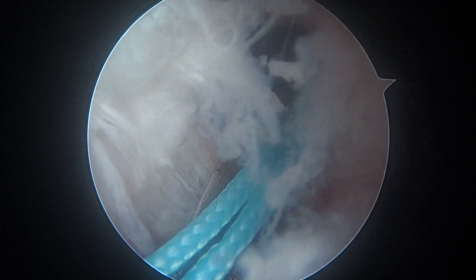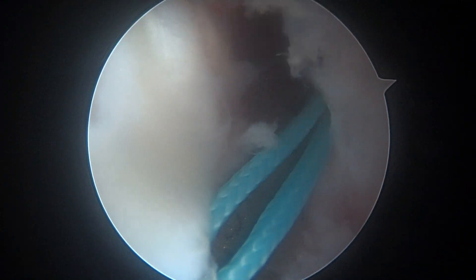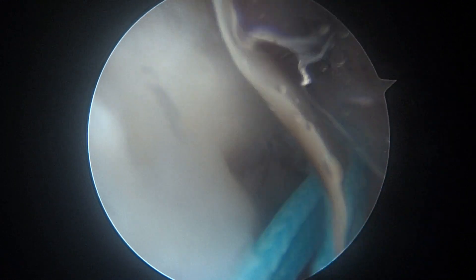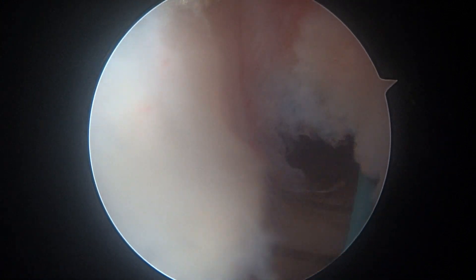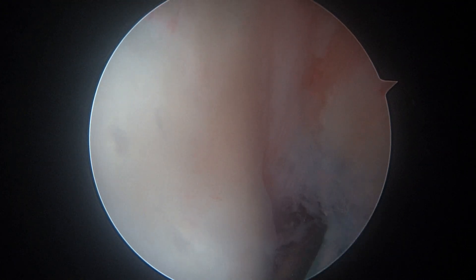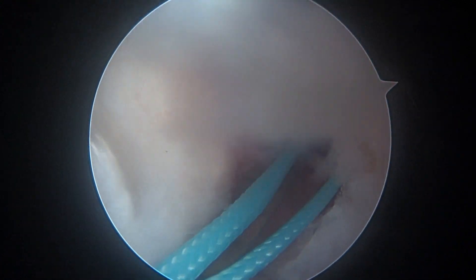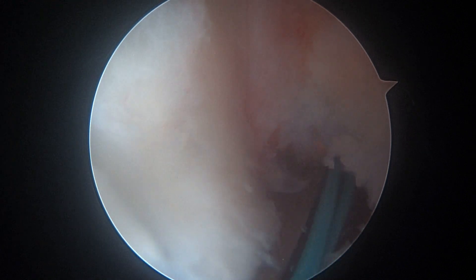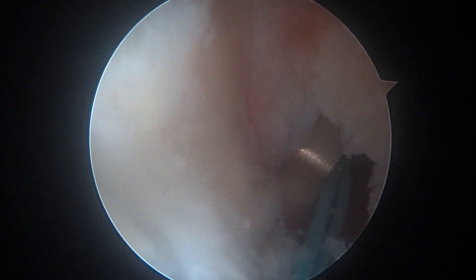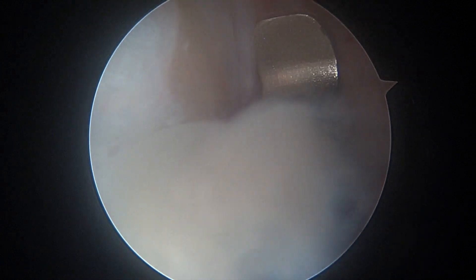So we've drilled our tunnels, and now we're just making some measurements so we know how to construct the graft. There's our ruler, hooked on the femoral cortex here. As we pull back and have a look — 50, 48, 46, probably 44. Let's do it again: 50, 48, 46. I'm going to call that 44 millimeters as the overall length of the femoral tunnel. Now I'm going to pull back and get the edge of the ruler just at the opening of the tunnel. I need another metal ruler to measure this distance — if we have another metal ruler, that would be helpful.